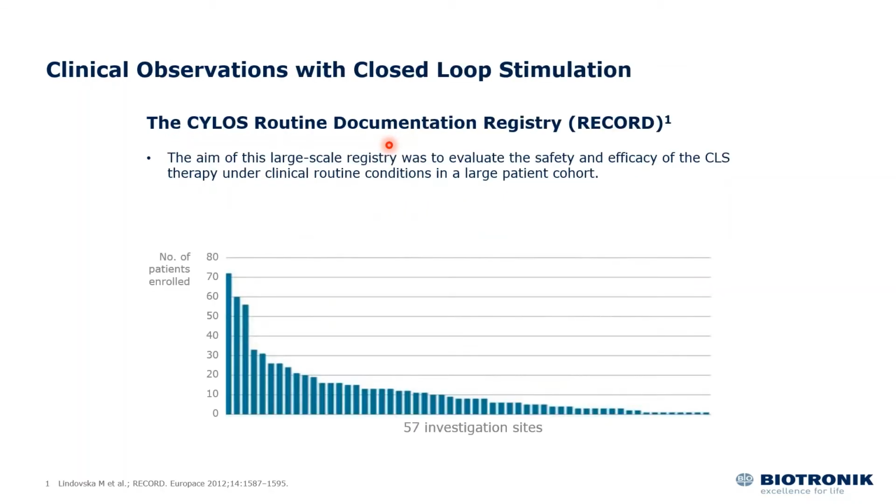So having said that, I hope at the end of the day you do understand the idea that the CLS algorithm utilized by the BIOTRONIK pacemakers is actually trying to improve the rate-responsive adaptive pacing of a pacemaker to a patient's needs, so that not only movement itself will translate to pacing rate increment, as we see in open loop systems, but even mental stress itself is also utilized as one of the inputs that will translate to increment of pacing rate in a CLS pacemaker.